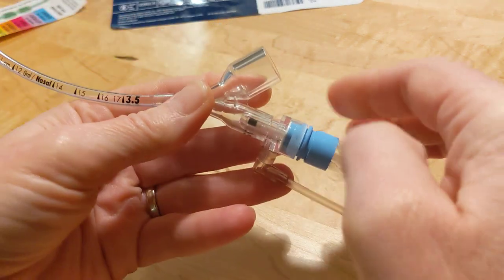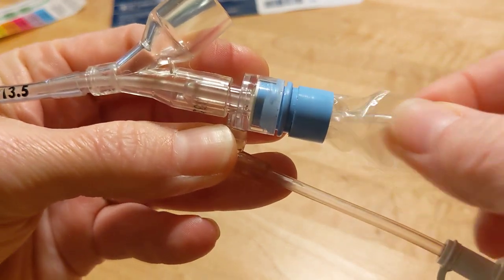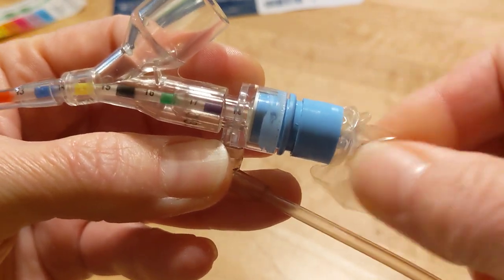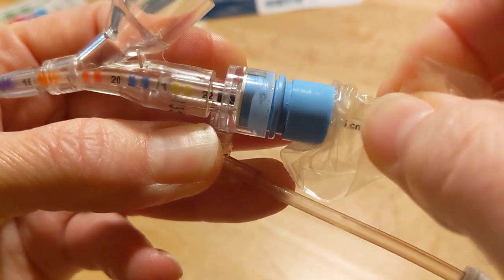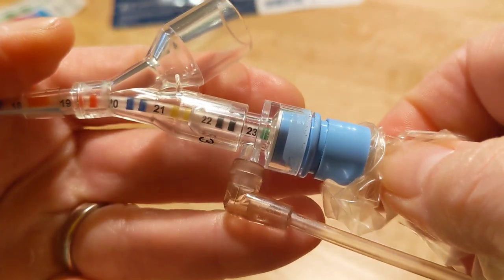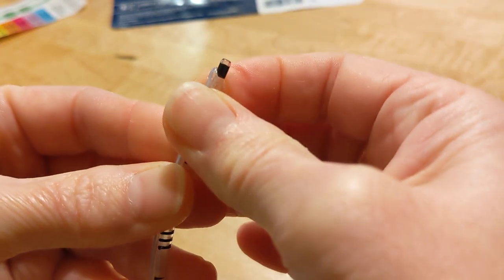So we're going to put that 23 in here. There's your double black and there's the 23. Now we're going to look at the end of the ET tube, and you'll see that the suction catheter is just beyond the end of the ET tube.